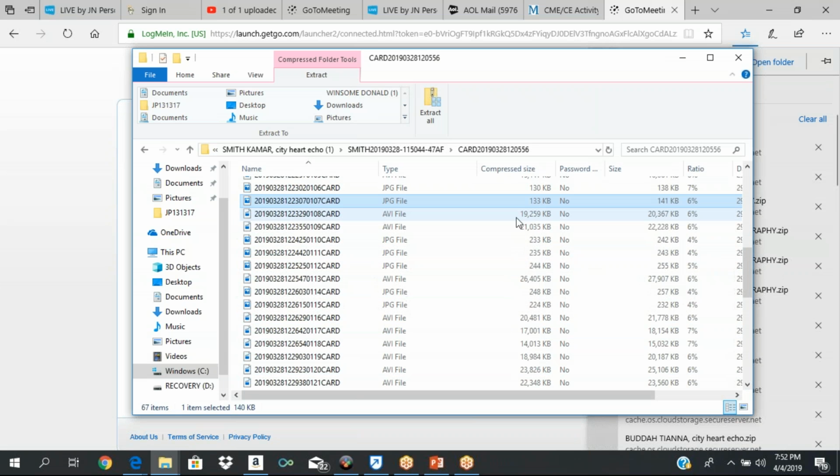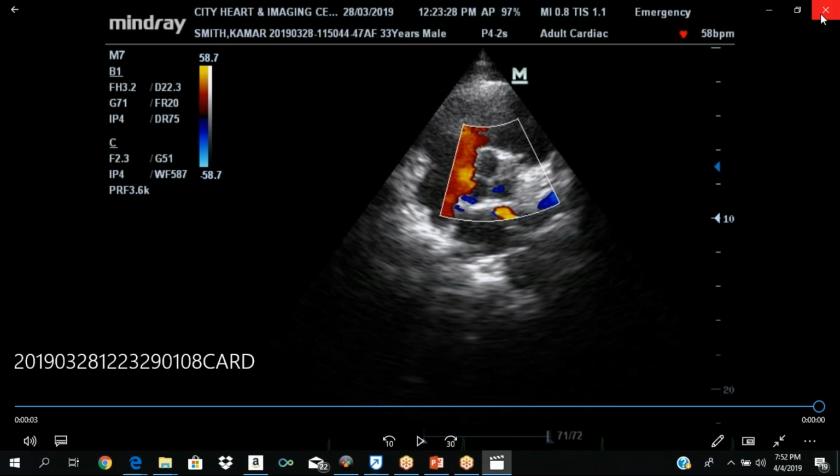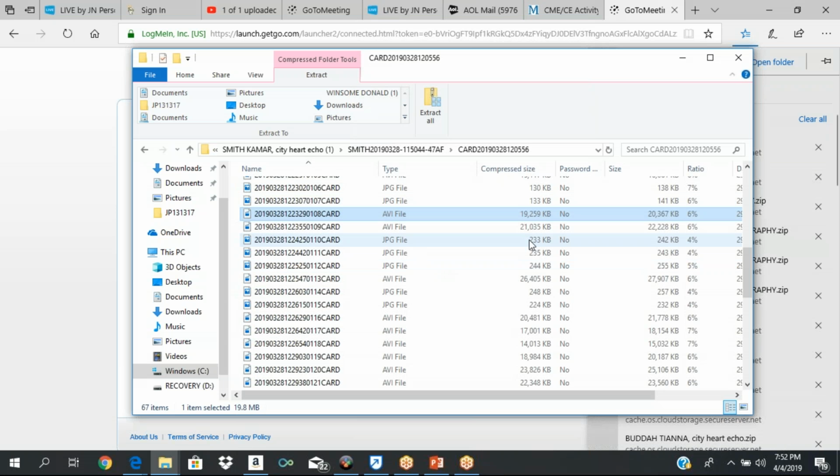So you should have in your mind's eye what image you're supposed to get, and you try and achieve that when you're scanning. If you don't have an idea what you're supposed to get, you'll settle for anything. So you need to have a clear idea what image you should be getting.